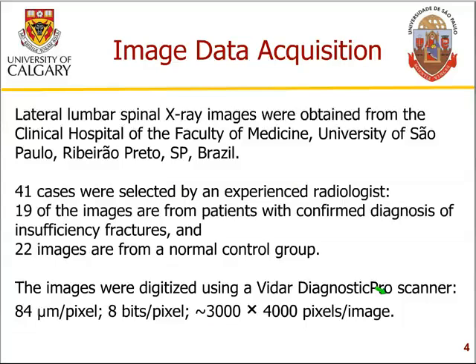The images used in our study, which is still in progress, and the results are to be seen as results of work in progress, are obtained by processing lateral lumbar spinal X-ray images, which are planar projection images. There are a few studies reported by other research groups where computer tomography and even MR imaging have been used. But of course, computer tomography involves the use of a higher radiation dose, and MR imaging is too expensive and hard to access in many areas of the world.